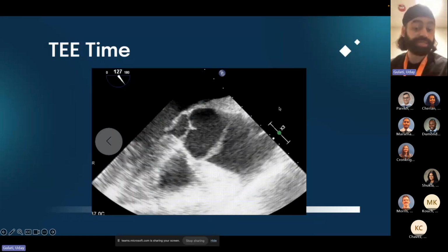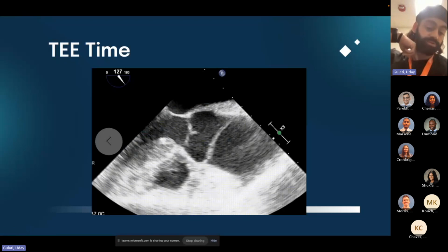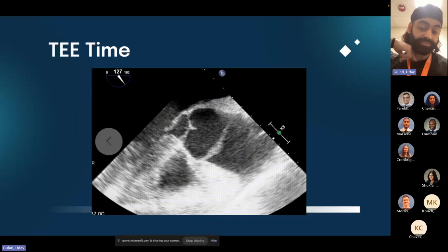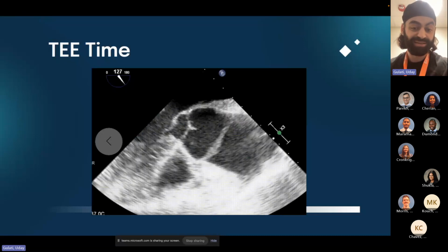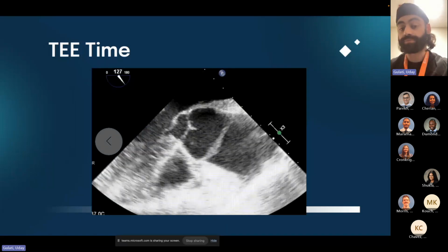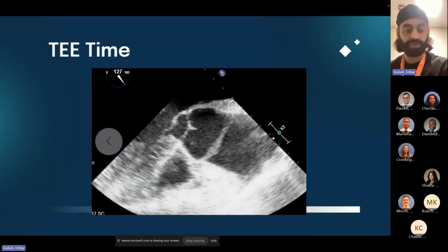And so you can obviously do transthoracic echo. If you're lucky, what you would do is put the probe up here and look down with transthoracic echo, that supraclavicular view. We've picked up an aortic dissection like this before, but I want to get a CT scan to see this. Versus if I have a patient in shock and I put that probe down because they're that sick, they might not be stable for a CT. And you put this probe down, you've identified your problem, and you can get them to the OR a lot sooner than if you relied on the CT, which I still look at as the donut of death.